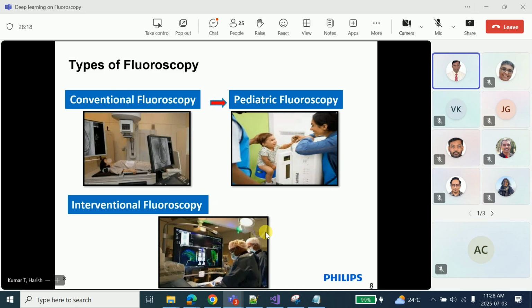And we have something called the IQX or a spot imaging. I'll come to all that as I go through the slides. There we have up to 8 frames per second. So the capture will depend on what you are finding. Okay. So also it depends on the part of the body.